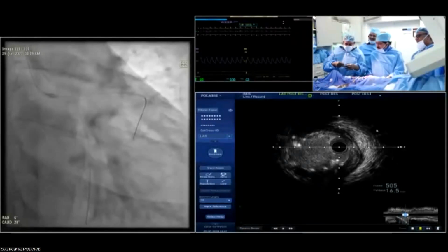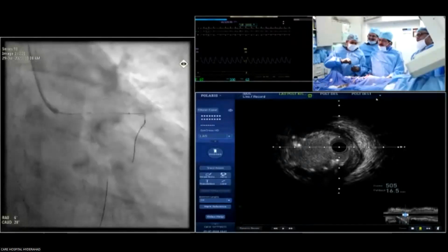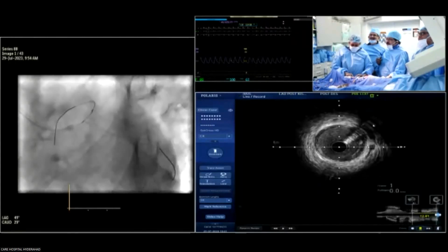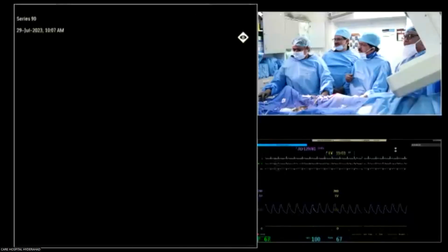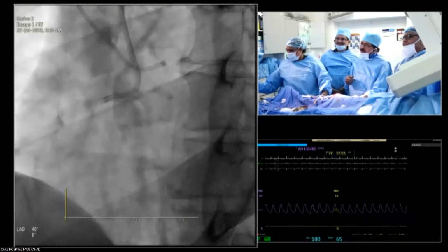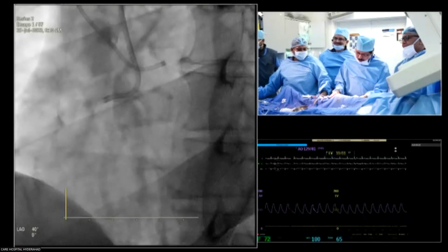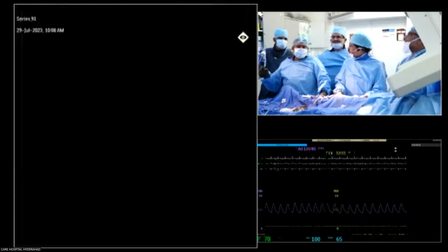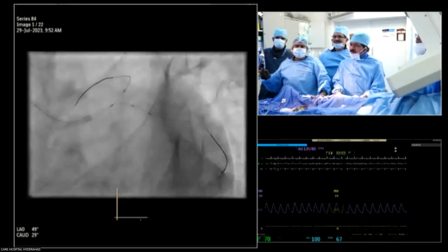Good morning. LCX, to be frank, it's not that critical. Can you show me all the angiofilms? Let him show the first angio. I think the picture you saw compared was after a balloon was dilated there. If it is too critical, it's better to do the LCX first and then go for the right coronary. Otherwise, if it's only 70 to 80 percent, not like 99 percent, then do the CTO and subsequently you can do the LCX.